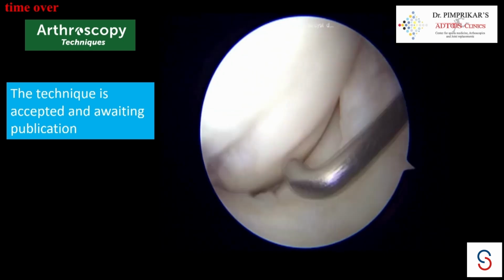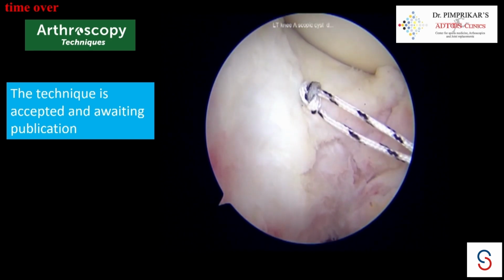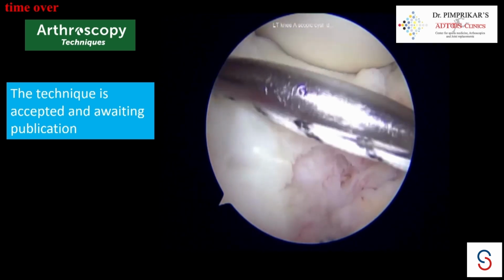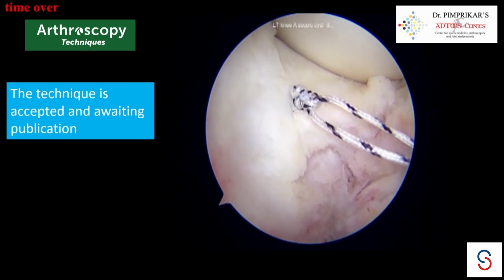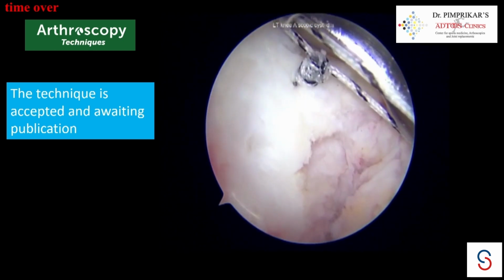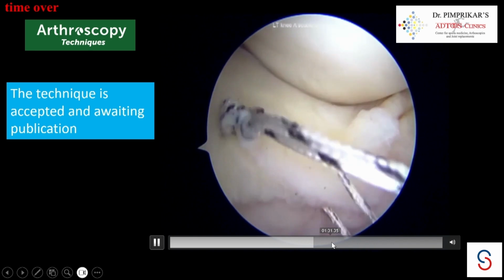So what we did is we took a mattress suture configuration with the help of a FiberTape mini. So that's the capsule, that's the bone, and that's the anterior horn of the lateral meniscus. We did a parachute kind of repair here, taking 2 bites and 2 horizontal stitches covering the maximum length of the anterior horn of the lateral meniscus along with the capsule. And once this was done, to take it a little fast ahead, that was the way the sutures were taken.